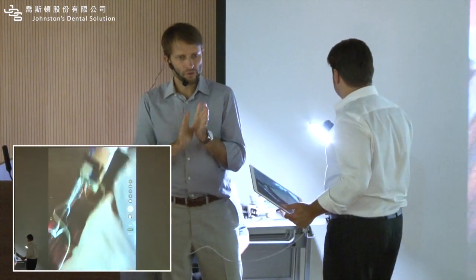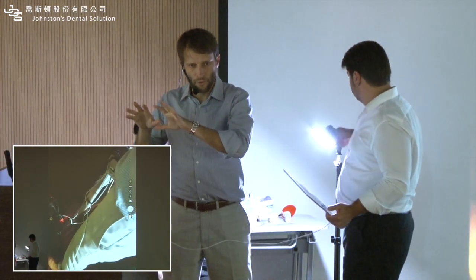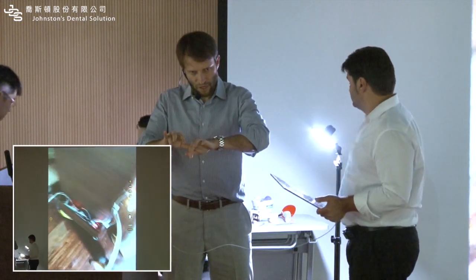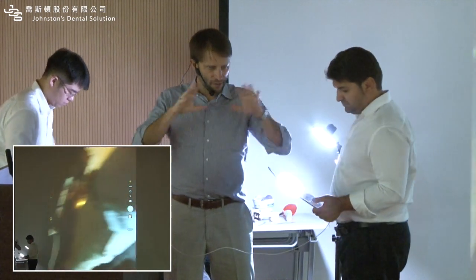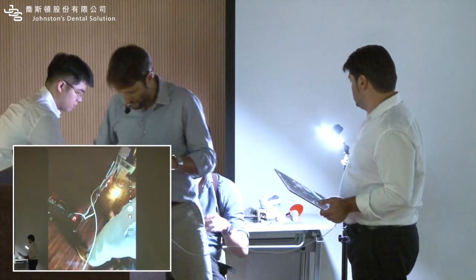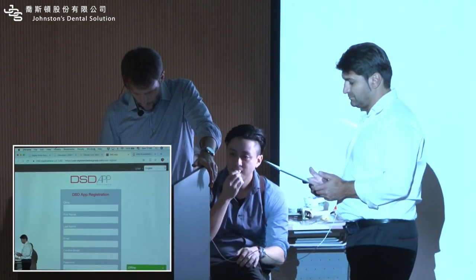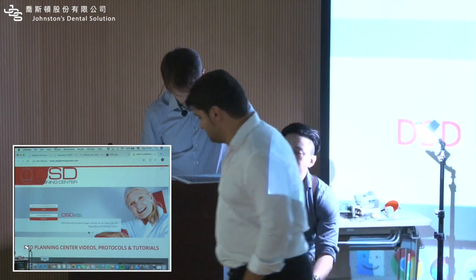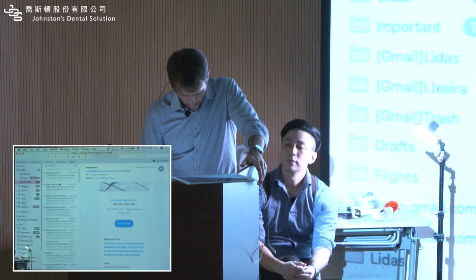So in 1 or 2 days, you get a notification. Case ready for your approval. You go open the case, you check the design, you ask for changes, you approve, back and forth, 1, 2, 3 modifications, 2 days, 3 days, ready, the files come, and you have everything done, okay? So what comes to me? I'm gonna get an email saying the case is ready. Let's see if I have an example here.